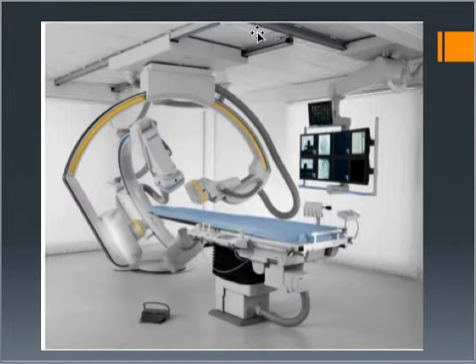This machine is moved on a ceiling track back and forth, so it can move up and down the table, and then here's your controls again for the table to run the C-arm and to move the table.